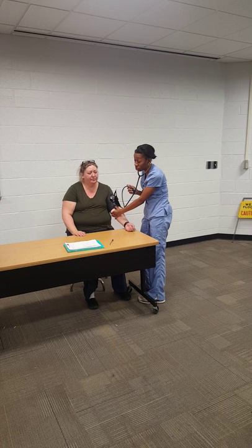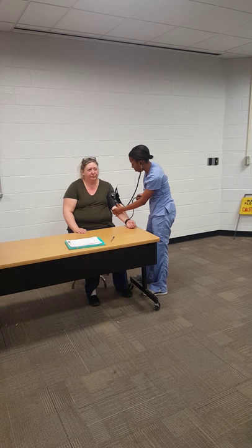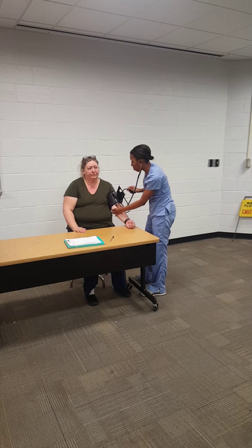You're going to turn the knob on the cuff all the way to the right to make sure it's tight and traps the air, and pump it up to at least 180. Once at 180, you're going to slowly let the air out and listen for when the heartbeat starts. Record that number.